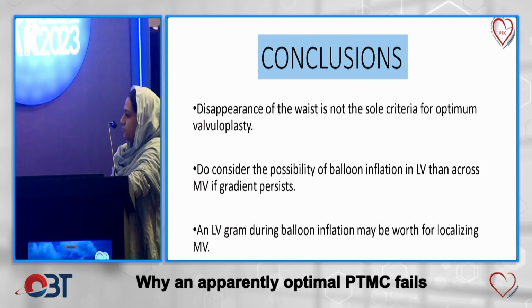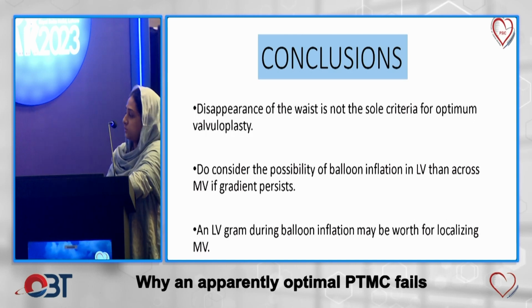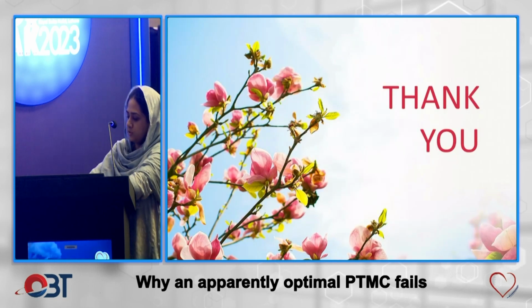So disappearance of the waist should not be considered as the sole criterion for optimal PTMC. Whenever you are not observing any fall in gradients despite optimal balloon inflation, do consider the possibility of inflating the balloon in LV. Thank you so very much.